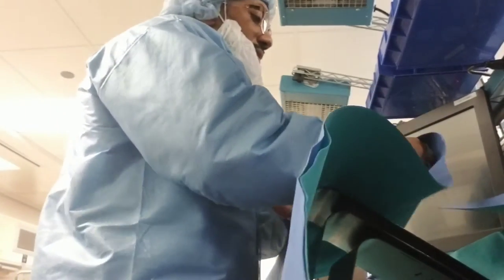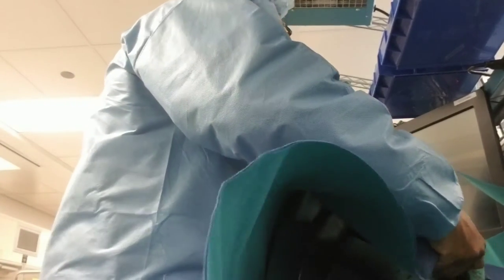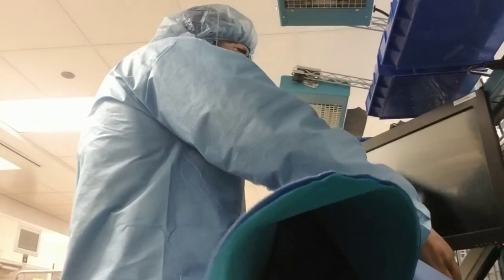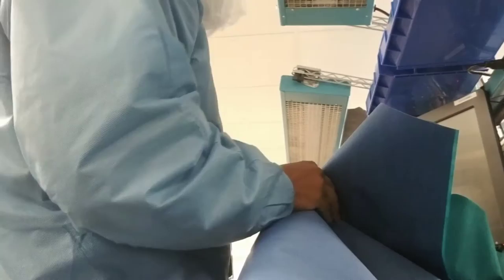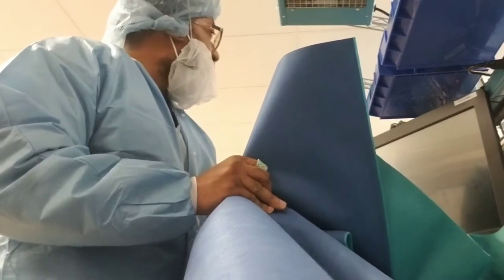So as you see, you want to place it in the middle, but you also want to lay it down flat, right? Some hospitals are different. Usually it's one triangle at a time, but being this hospital, they prefer you to wrap all three at once, which makes it a little more difficult. So this is one of the hardest items to ever wrap in the sterile processing. You OGs out there know how hard it is for people to wrap a triangle. This may be one of the toughest things. So I wanted to do a video that shows you actually how to do it.